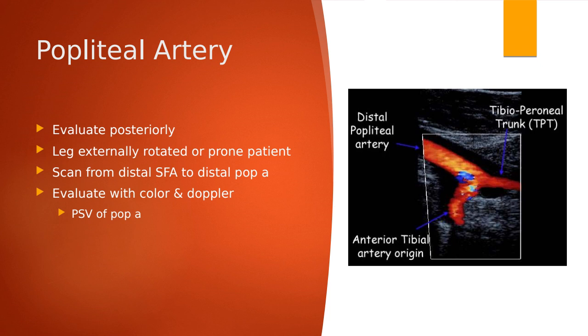So in this case, remember, when you're doing an arterial leg, your popliteal artery is going to be below your popliteal vein. Also, we want to spend a little bit more time back here because we want to make sure we see the junction of where those calf vessels are coming off. It's a little bit easier because it's the arterial system, so we don't really have to worry about getting them to fill. Arteries are typically easier for us to find than veins are, especially calf arteries versus calf veins. So we need to spend a little bit more time in this posterior knee region to see where our ATA is going to come off, where our tibioperoneal trunk is going to be, right? Because we know our ATA is going to come off before the tibioperoneal trunk. Tibioperoneal trunk is going to split off from itself a little bit lower down.